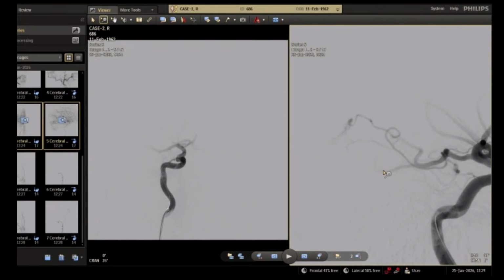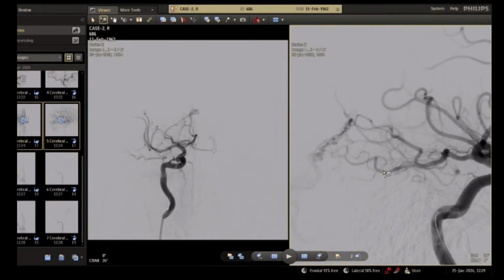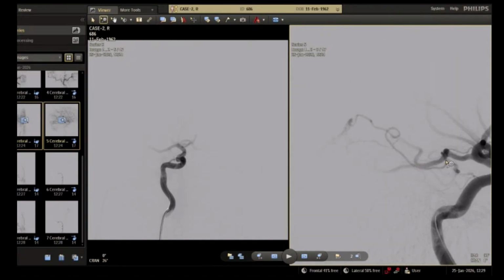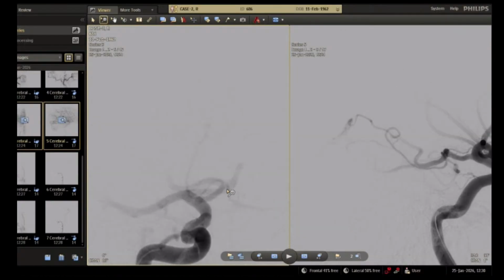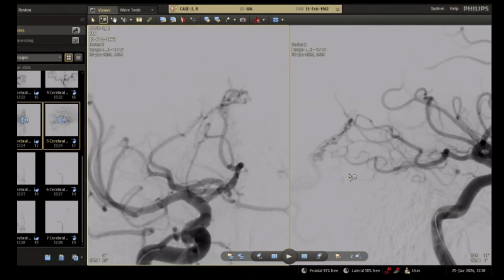it's also the branch. This branch is going, it's quite small and going from this point. It's something small, yeah.